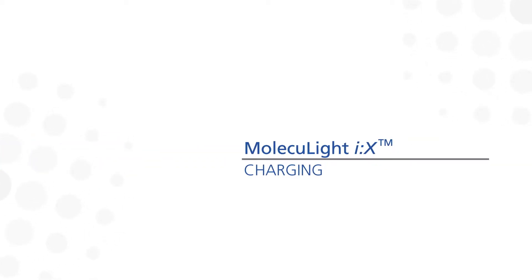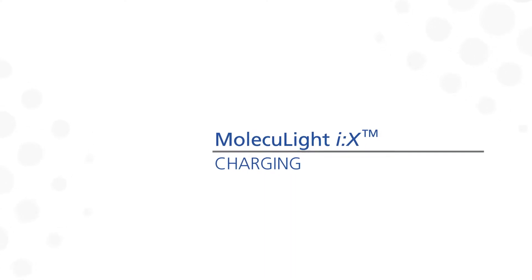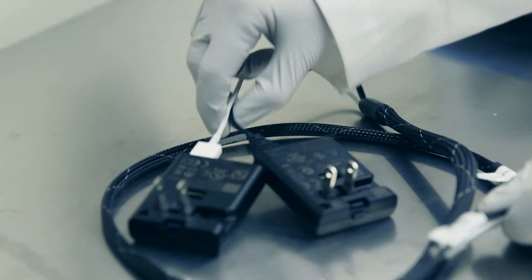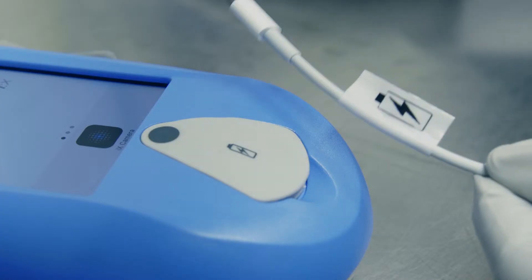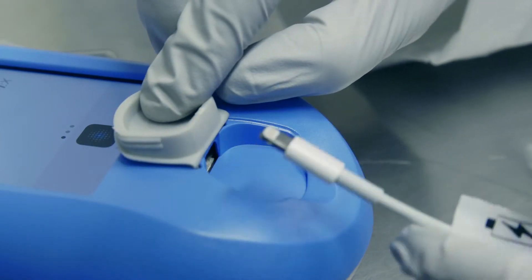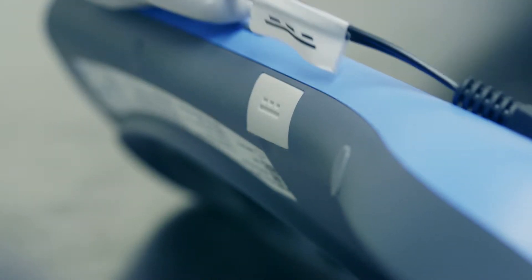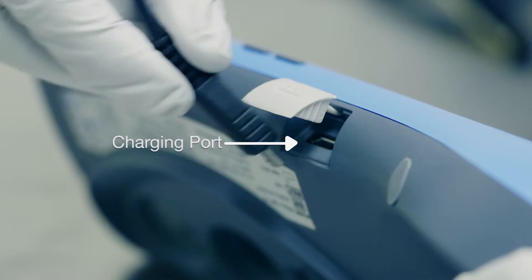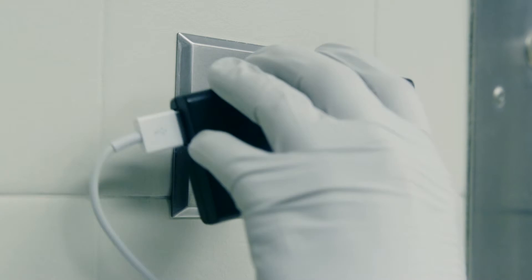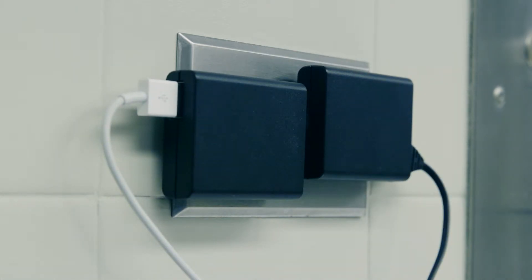Just like any battery-operated device, it's important to make sure the Moleculite iX is fully charged so it's ready to go when you are. This is the Moleculite iX connecting cable and this is the Moleculite iX power cable. The first step is to connect the Moleculite iX connecting cable into the port on the display screen. Then connect the micro USB power cable into the charging port on the side of the device. Now you're ready to connect the ends of both cables into an electrical outlet. The device and the display screen charge independently, so it's important to ensure both are charging.